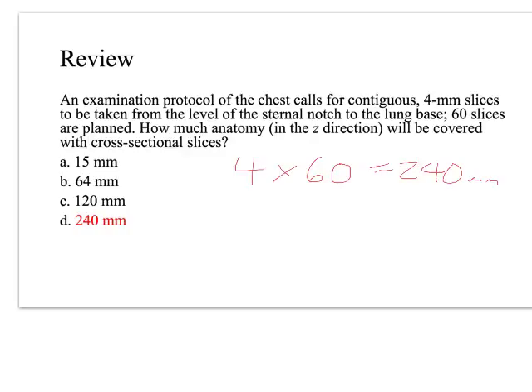Well, I would need to know how big their chest is, right? And so this is one of the reasons why we don't sit around and do the math. We think about it geometrically and we just draw the box on the localizer scan. If we were computers, really all we're doing is just saying, I want you to travel along 240 millimeters. You tracking with me? We are able to think very rapidly in this geometrical way, but there's a very similar process that we can talk about algebraically as well.